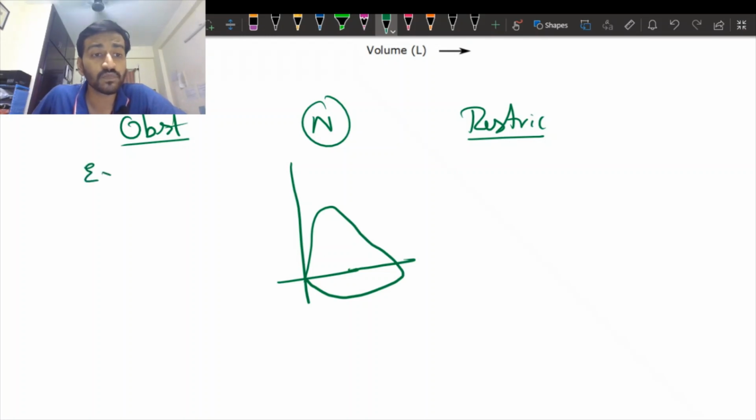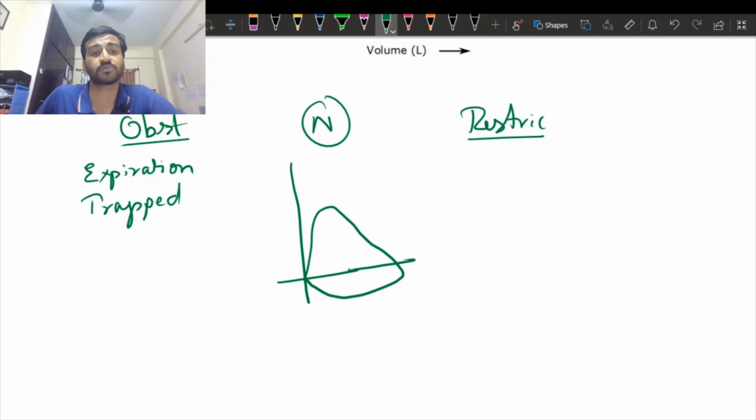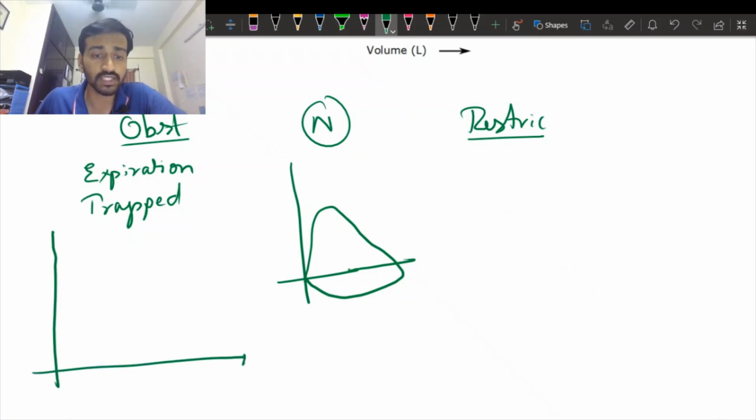It is with the expiration. Okay, if there is problem in expiration, the inspired air is getting trapped inside, okay, and not being expelled. So what happens here? Let us see. Let us draw the graph based on that. So this is, take this as 0, 2, 4, 6, 8, 10. Okay, for example, for instance, so whatever we do, we draw a normal here.